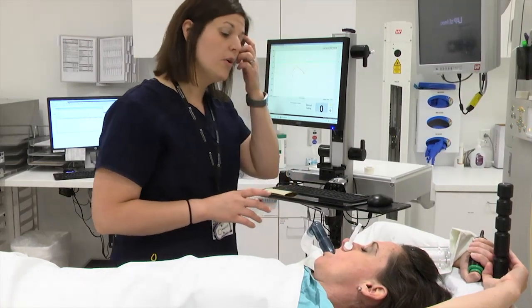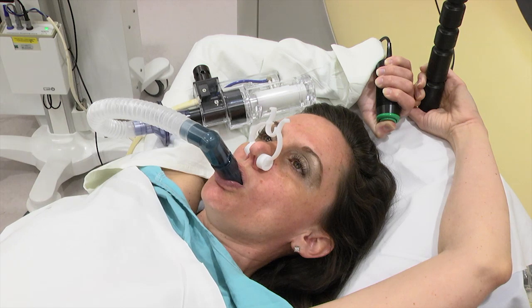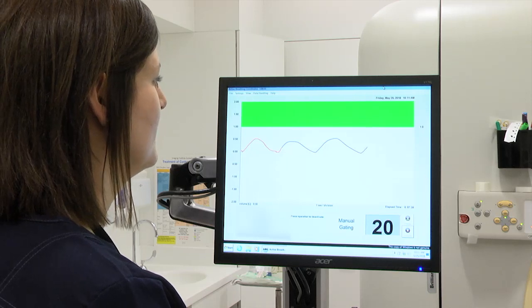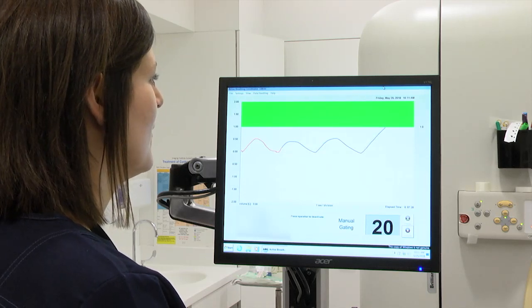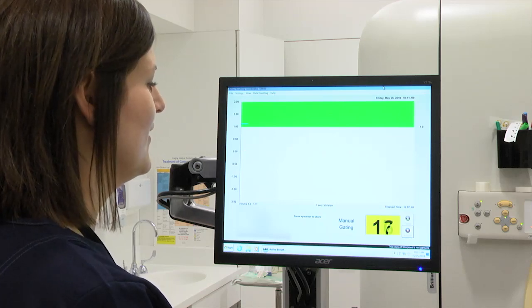After this, you will be asked to take a deep breath. You will press the green button on the handle and hold it. Pressing the green button will tell the therapist you are ready for the breath hold. Once your breathing reaches the threshold established on the computer, the ABC device will then be activated.